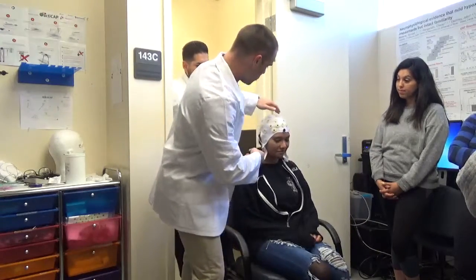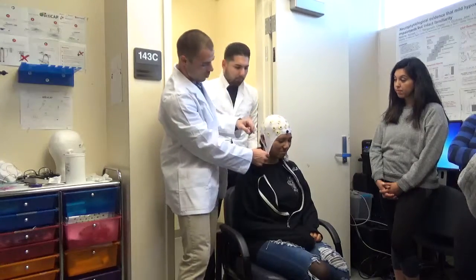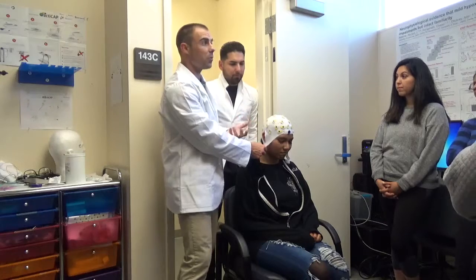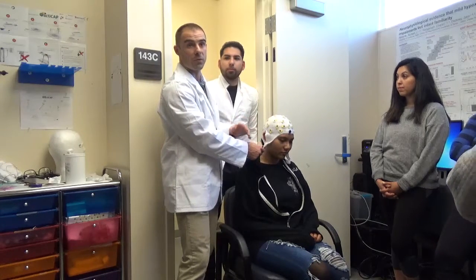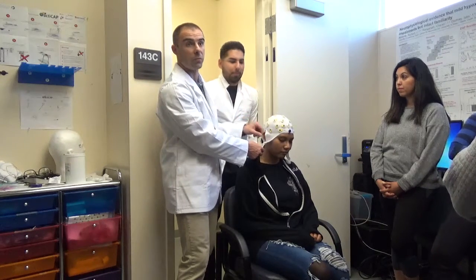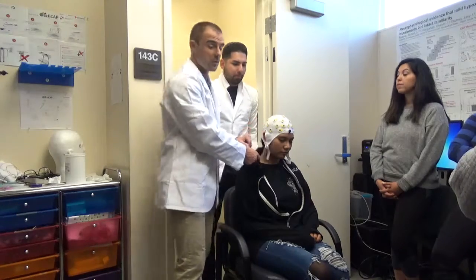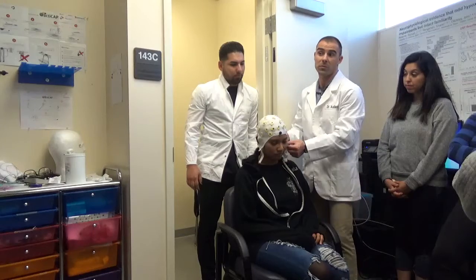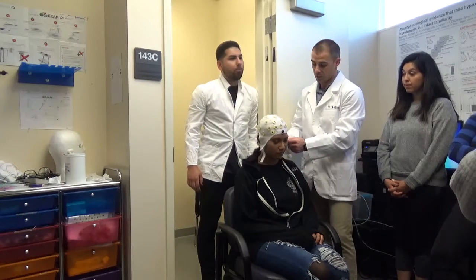Good. And what you guys can do is, see that we've got these nice comfortable ear slots. Okay? You can do it any way that they prefer, but you should know that just about everybody tends to report that it's more comfortable to have the ears coming out of the slots. So you want to make sure that they're set up like that, because they're not always going to talk with you. Sometimes they're still kind of intimidated.